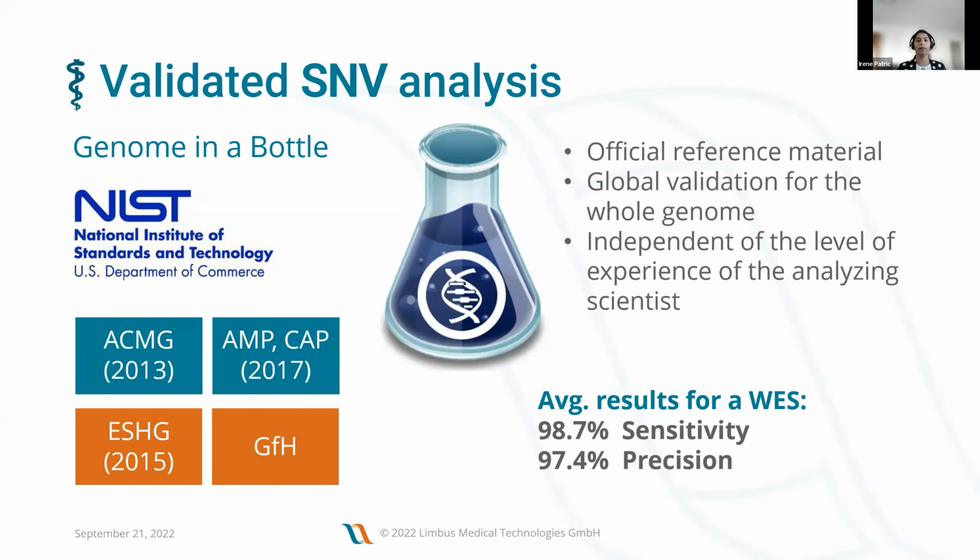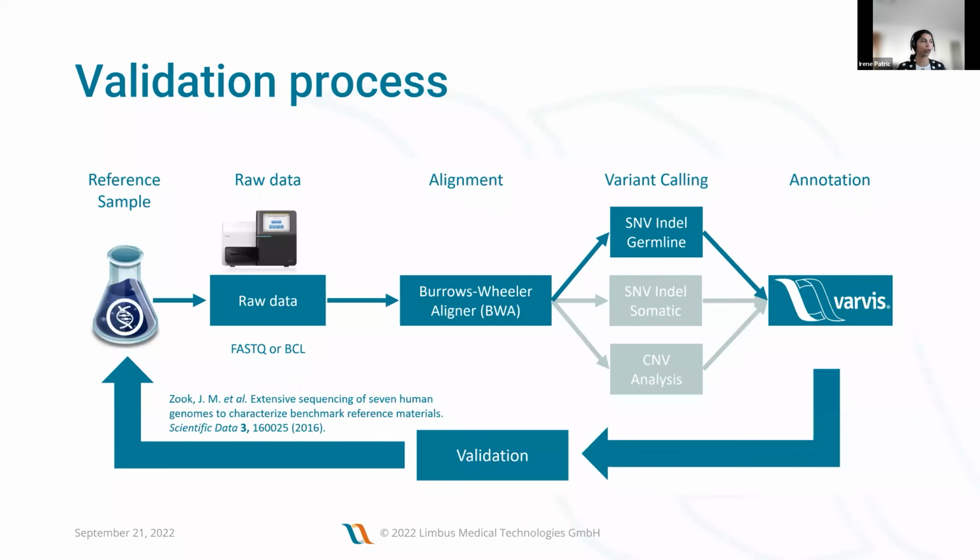Now, there are certain sensitivity requirements that are set up as the guidelines for medical standards, and we always ensure that with any change in the tool or the workflow, we are in compliance with these requirements. So what does this mean for the laboratory? What would the laboratory have to do?